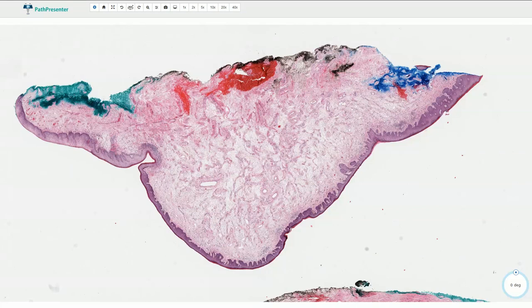Aggressive angiomyxoma, also called deep angiomyxoma, is a hypocellular locally aggressive myxoidematous neoplasm with prominent blood vessels, which typically occurs in the vulvovaginal regions and also in deep pelvic tissues.